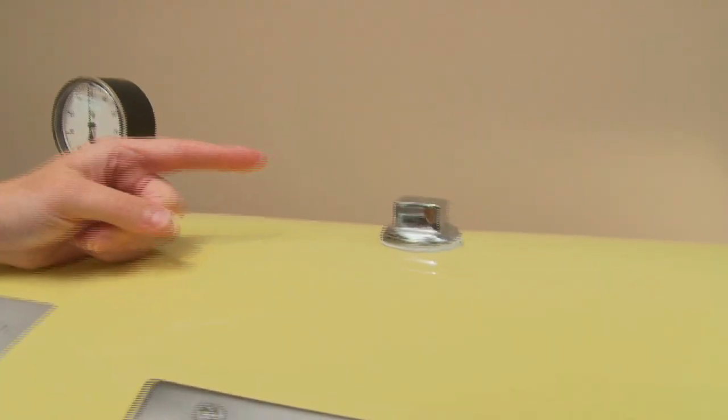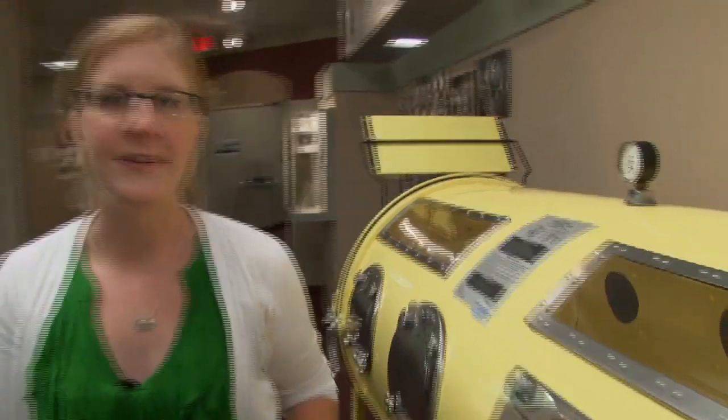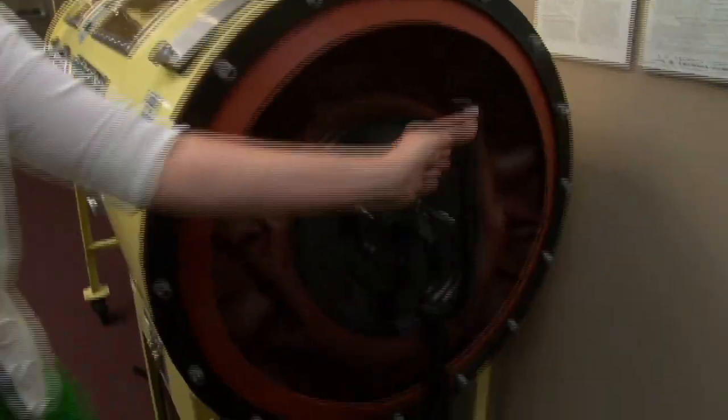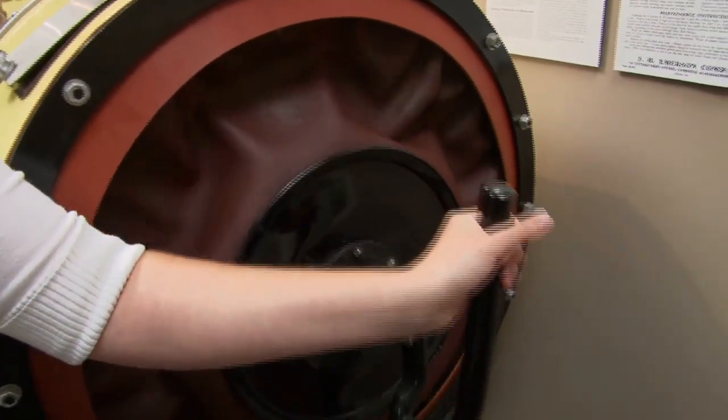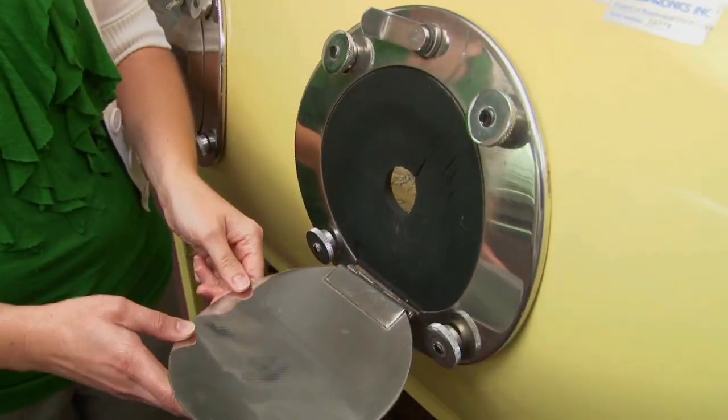Next to it would have been an alarm where a light would go off if the pressure inside the chamber goes below a certain level. In case of electrical failure, there's a handle at the rear of the machine for manual operation. Along the side are ports for nurses to access the patient and windows.